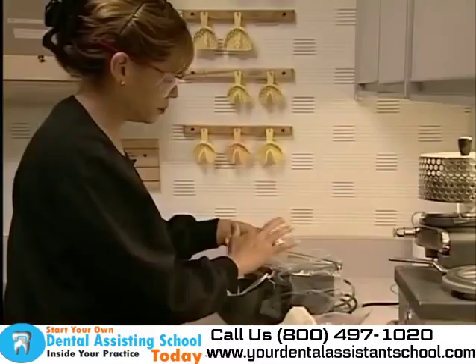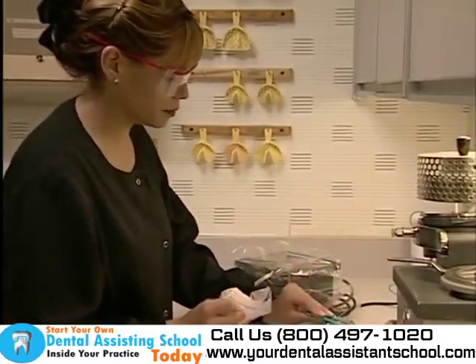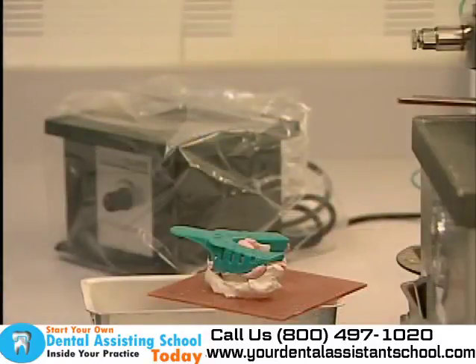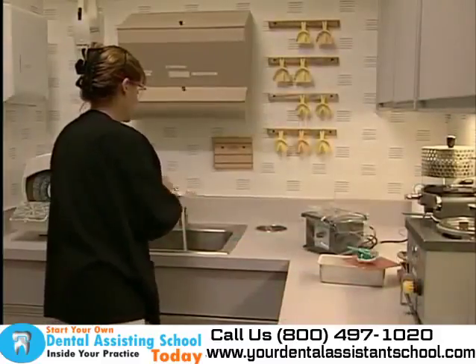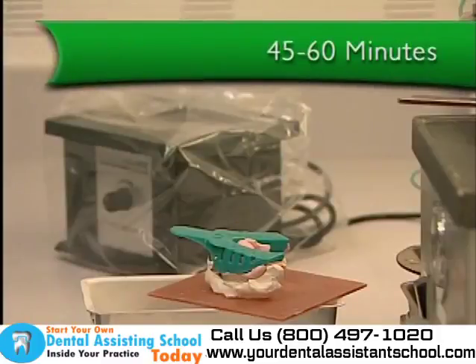When the impression has filled with gypsum, a base is made, and the impression tray containing the gypsum mixture is inverted onto the top of the base. While setting, a chemical reaction takes place and the gypsum material is warm and damp. It will take roughly 45 to 60 minutes for the mold to set.